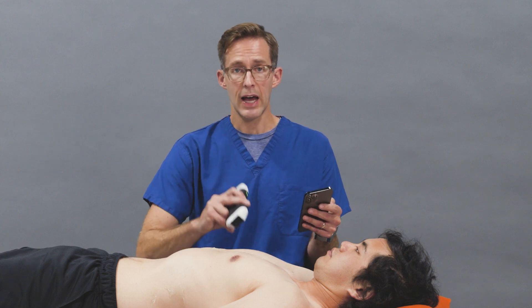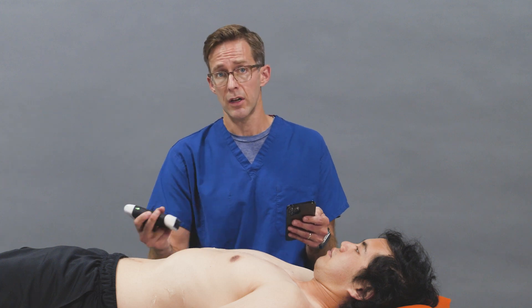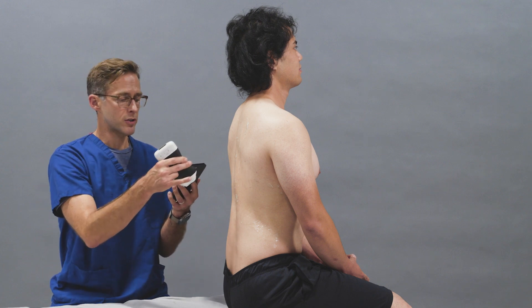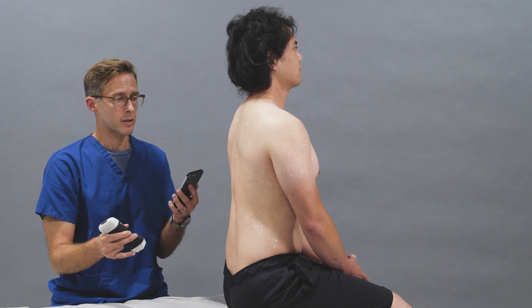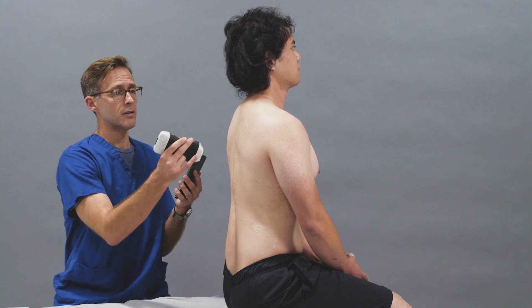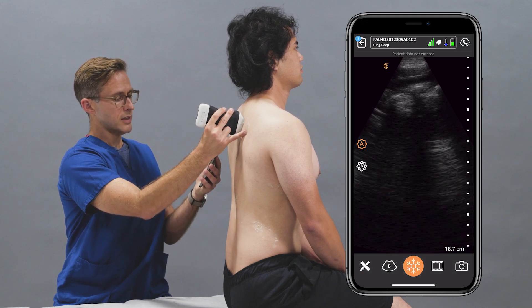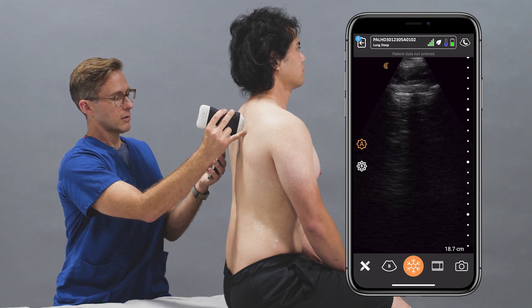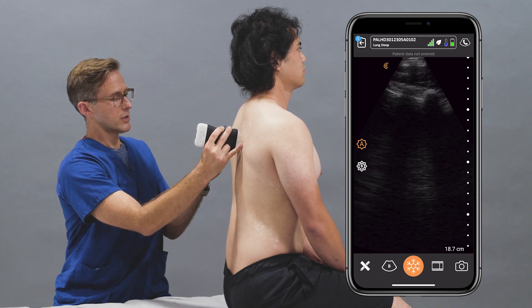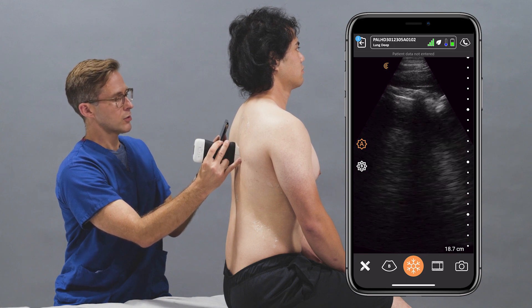That's the anterior and lateral lung scan. We'll have the patient sit up to perform the posterior aspect. Now that we've completed the anterior and lateral evaluation, the last part is to evaluate the posterior aspect. I have the patient touch their hands together so you can get some scapular movement. I start towards the head with a depth of about 18 centimeters and go down the lungs to ensure A lines are present, no B lines or pulmonary edema, and no pleural effusions or consolidations.